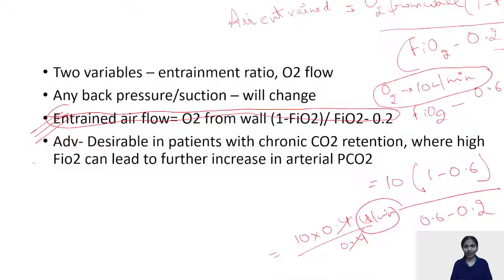I hope I'm very clear about it, that you should know how much air can be entrained from the Venturi mask according to the FiO2. Advantages are that Venturi masks are actually very useful in cases of chronic CO2 retention. I repeat, the basic use of Venturi mask is in chronic CO2 retention cases.